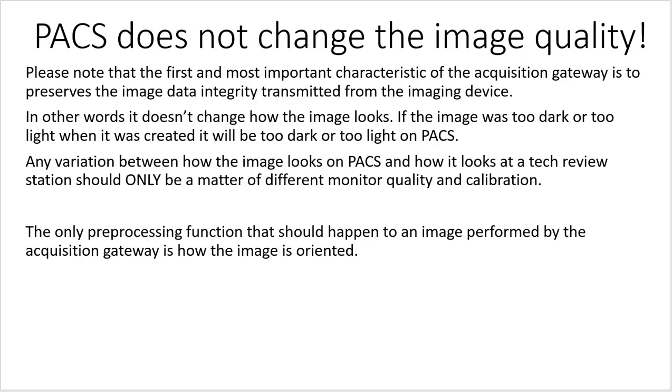So, PACS does not change the image quality. Technologists will always say things like, oh, my images always look darker on PACS, my images always look lighter on PACS, my images look this way on PACS. It's just their perception. It is not reality. It's just because they took a poor image, and they want to blame it on the technology.